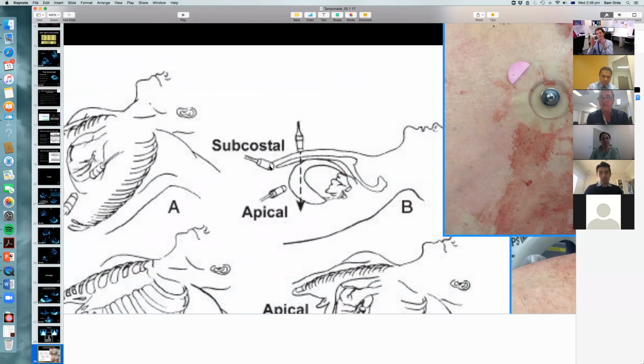try and dilate. I don't know if you guys have found this from doing subcostal approaches all the time, but sometimes in a difficult case, you've got the dilator all the way in, you take out the dilator and you still can't feed over the pericardial drain because the crura of the diaphragm is so strong. You open them up and then because it's such a thick fibrous structure, it closes straight off again. And so often, even with all the dilation in the world, you still can't put your pericardial drain through.